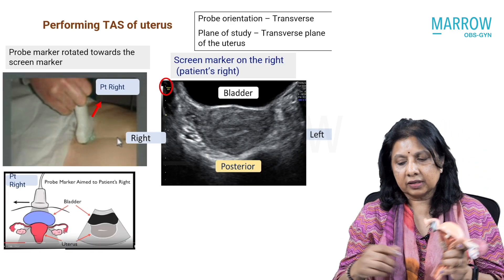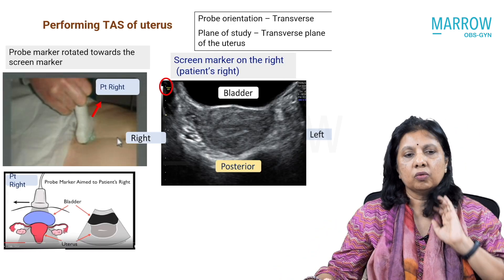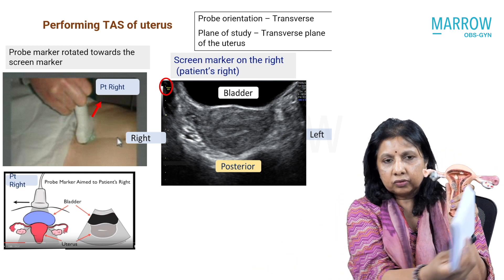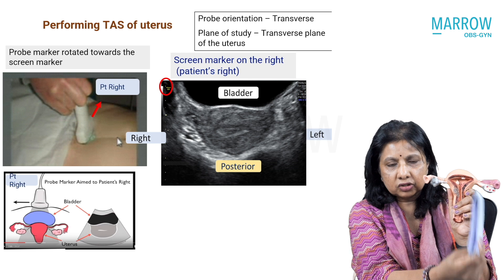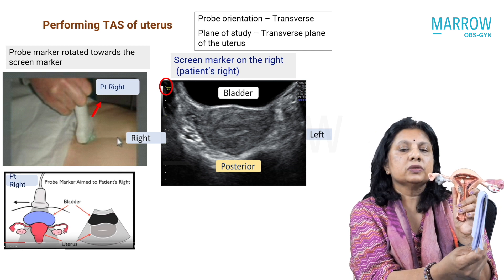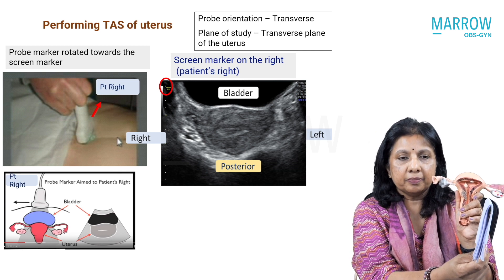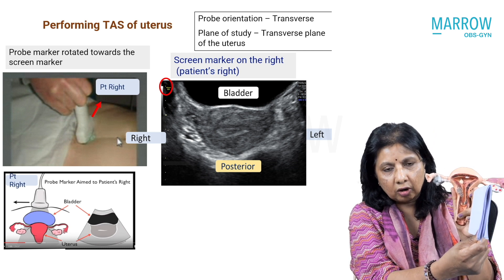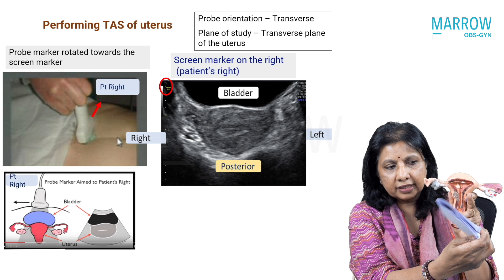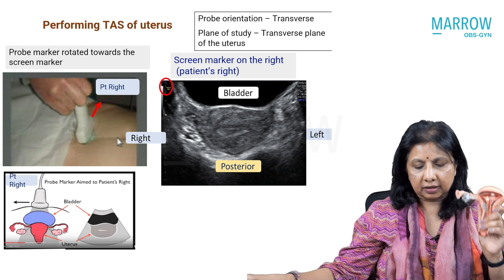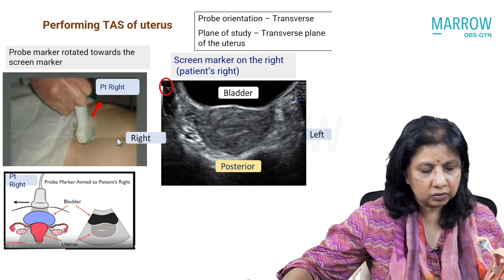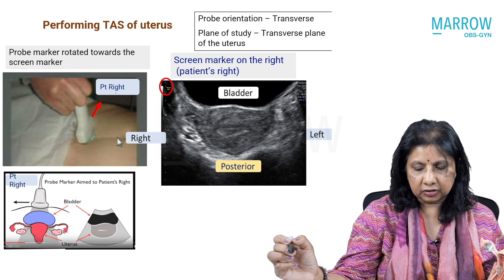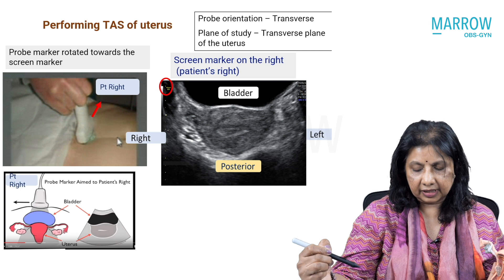Now let's look at the transverse plane of the uterus. So what do I do in a transverse plane? This is my sagittal — this is my uterus, this is my probe held sagittally. For the transverse plane, I will rotate my probe so that the probe marker is always on top, rotated towards the side of the screen marker. When I do that, as you can see from these images, the probe marker is facing the patient's right.